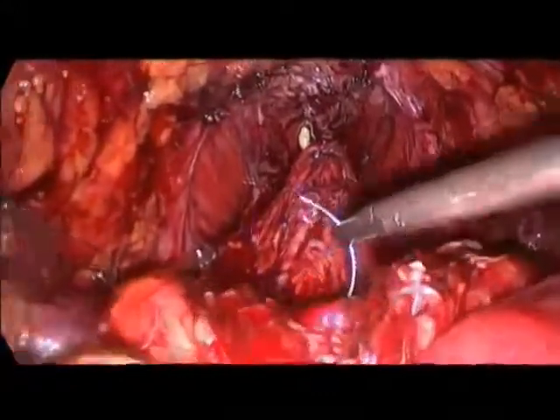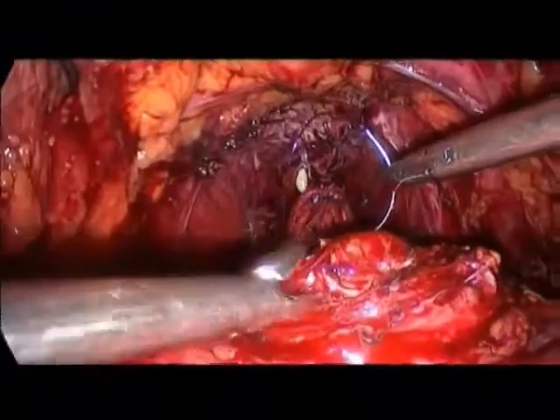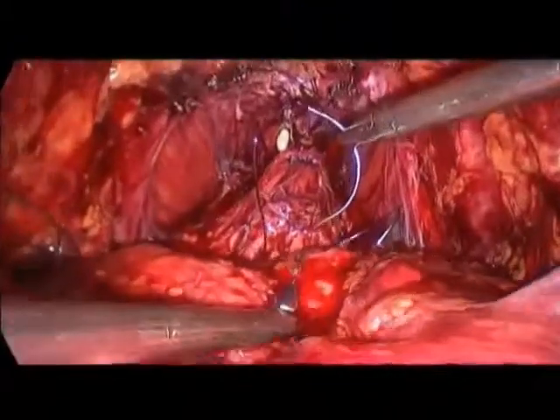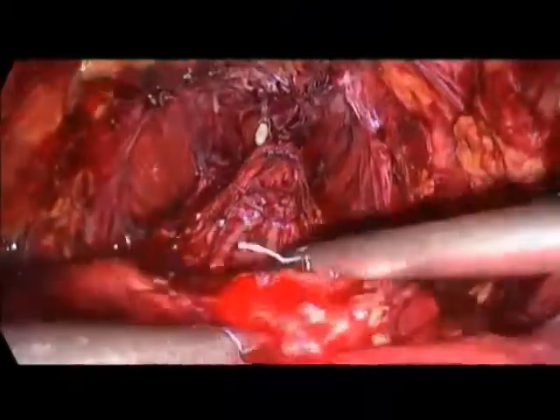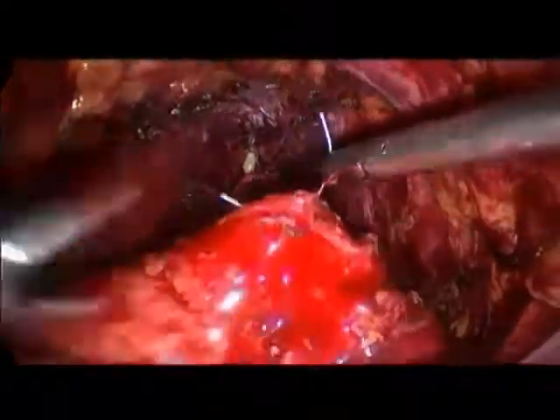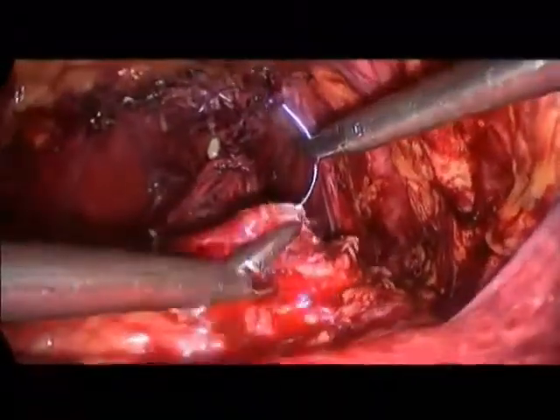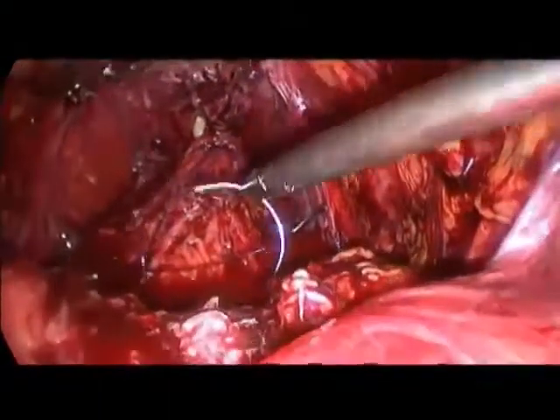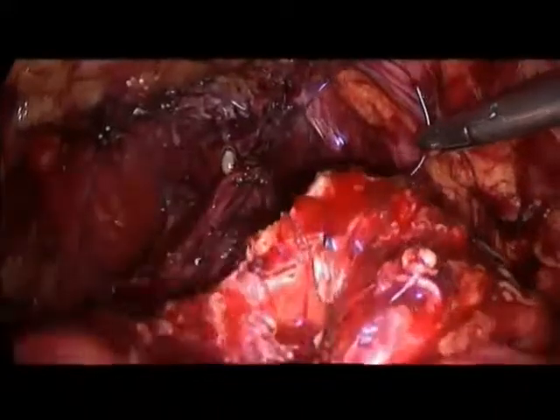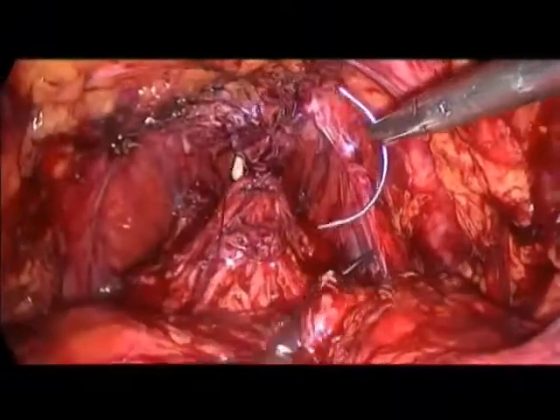Roland, why are you not using two colored stitches? Like we are doing it, dyed, undyed? No, I'm using two stitches of the same color. And as you can see, the tricky moment is the finding of the bladder neck, mainly when it is nicely preserved. Here we have the anterior aspect, but we still have to fish the posterior lip to make sure that we are at the appropriate level.